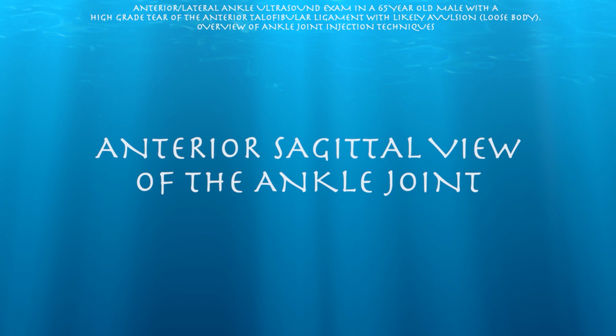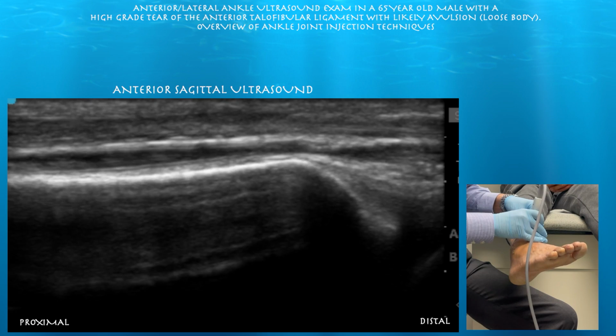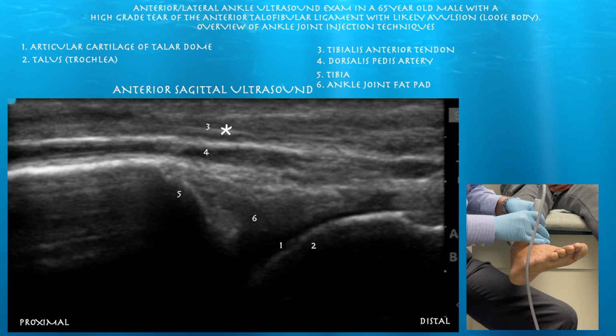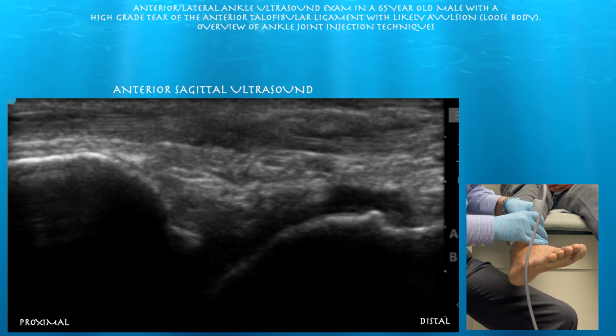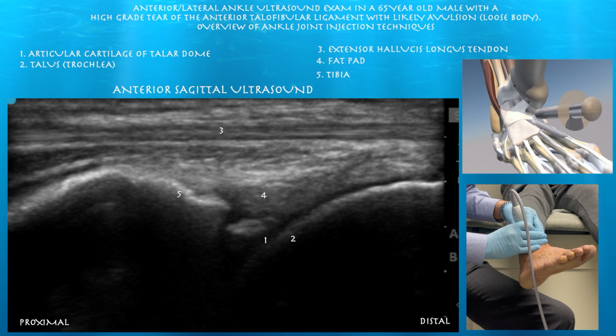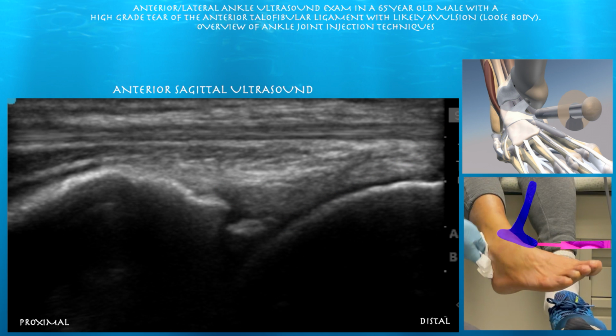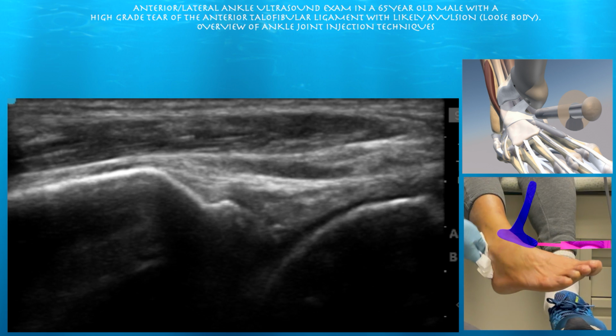Now we're going to look at the ankle joint itself, just part of our exam here. Here you can see the dorsalis pedis artery, essentially underneath the tibialis anterior tendon at this view. You can see the talar dome. Appreciate some of the hyaline cartilage over the dome. You can also appreciate the fat pad within the ankle joint itself. And when you do an injection, you essentially just want to get the needle underneath that fat pad. And you really want to get your needle between the extensor hallucis longus and tibialis anterior tendons, and not through the tendon, which you see here.